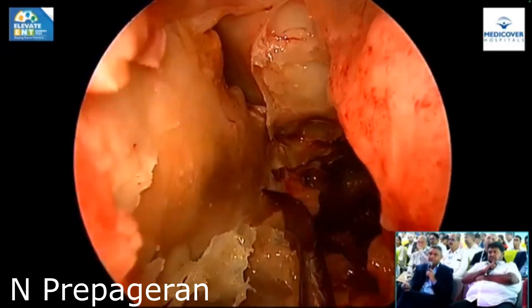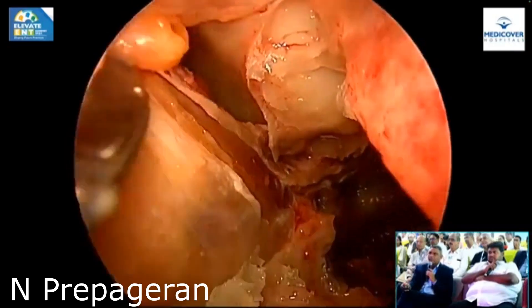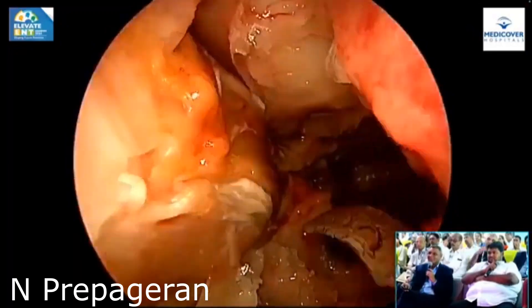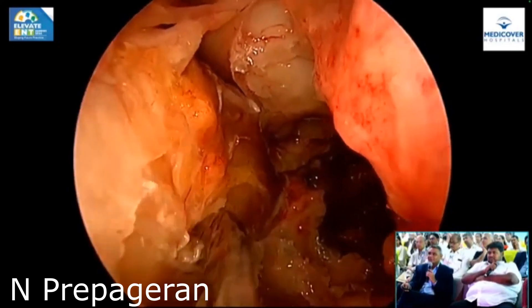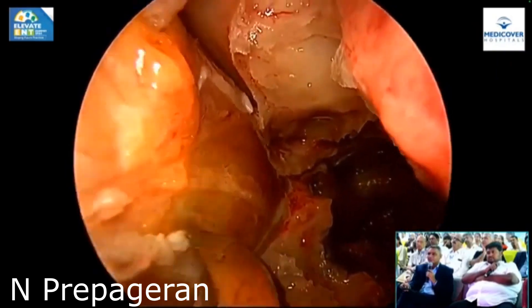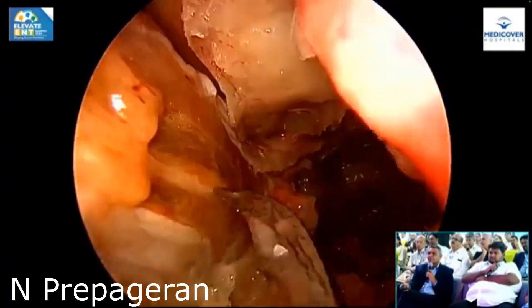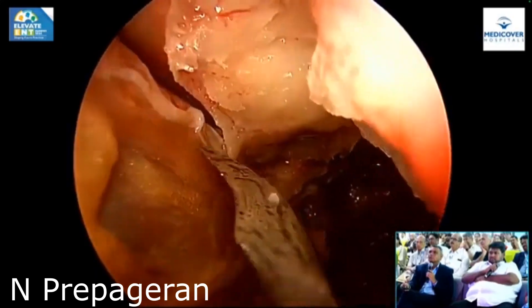Now I'm going to cut the periorbita. Most people cut in three lines, but being born lazy, I just make an apron and cut and remove the whole thing like an apron, which is much easier in real life than in cadavers. So instead of doing three lines I just remove the entire periorbita as much as I can. Now we are looking for muscles. Here is orbital fat — typically a lot of orbital fat posteriorly. I'm going to remove the orbital fat to identify the medial rectus muscle.